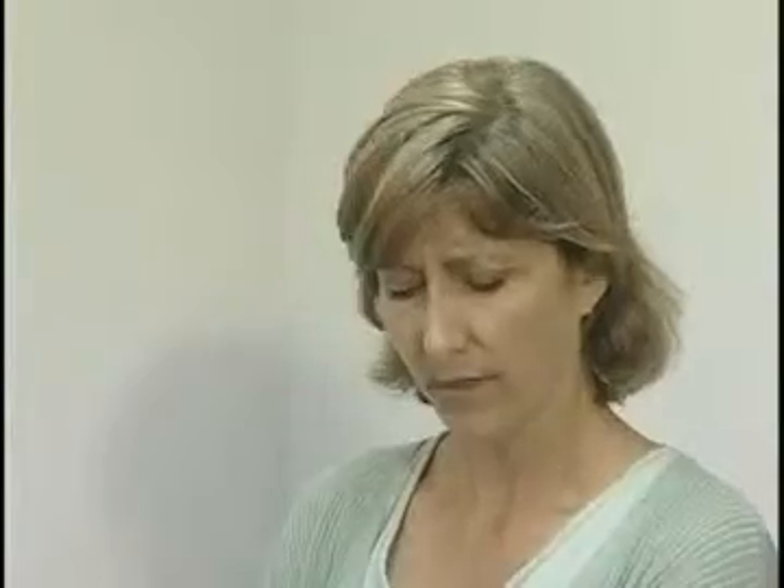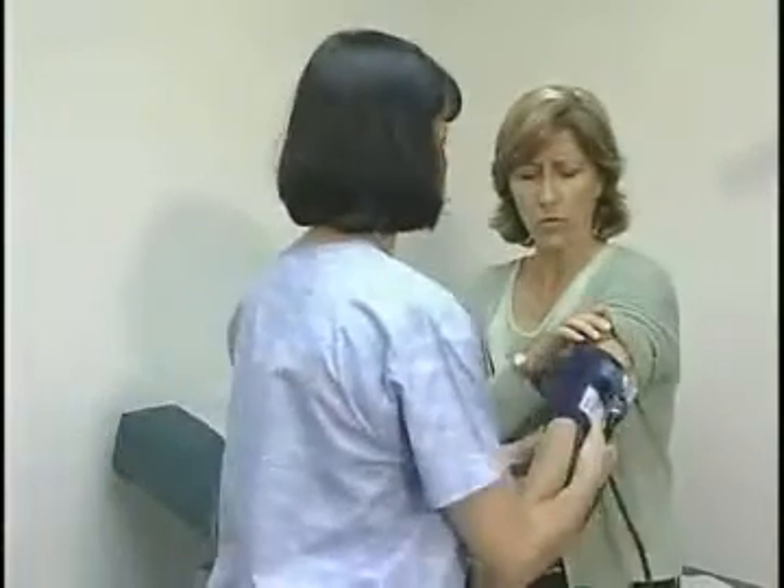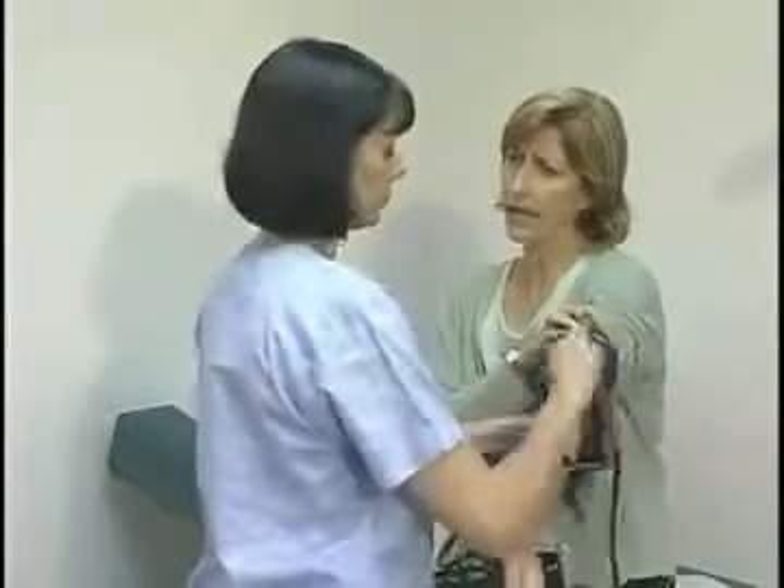Up next, I'm going to take your blood pressure. So would you mind rolling up your sleeve? But take a little of the mystery out of this for me, because the doctor has told my husband to take his blood pressure every day. What is it that you're measuring, and how do you find it?